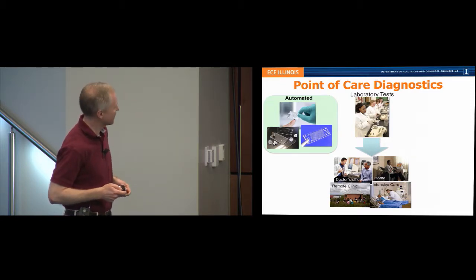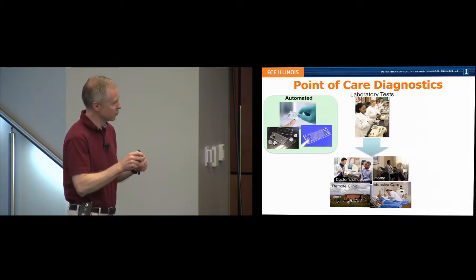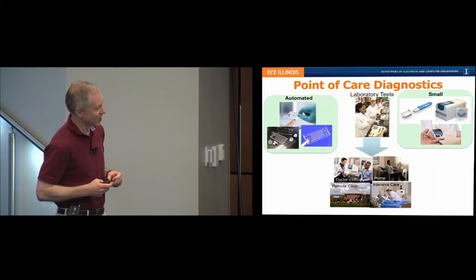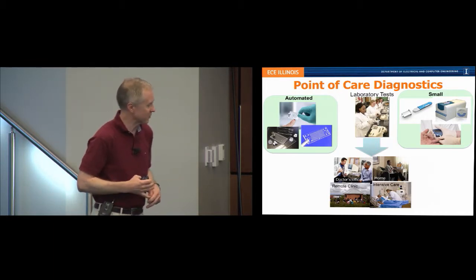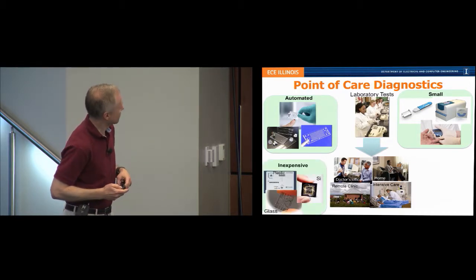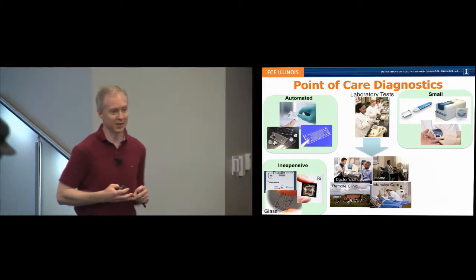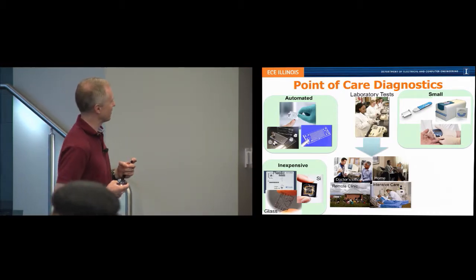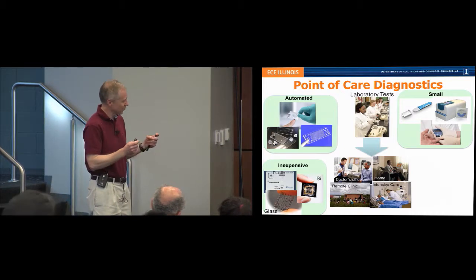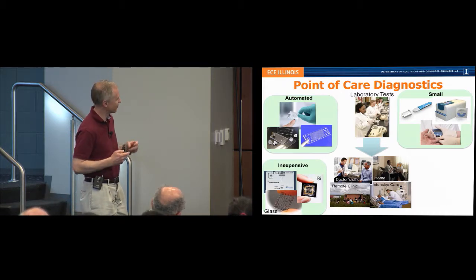And so people make small plastic cartridges that have little valves and pumps in them that can move liquids around and do the things that the technician would have done, but now do them automatically. The detection system shouldn't fill an entire room, but be small, maybe even handheld or the size of a shoebox. These things have to be inexpensive. When people talk about the cost of a test, it needs to be like $5 or less. And so the items that are used for the test, the biological reagents, the thing that holds the liquids and does everything, usually have to be made out of something cheap, like silicon or plastic or some combination of both.